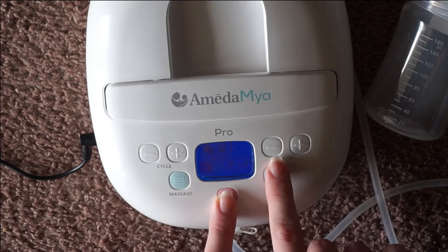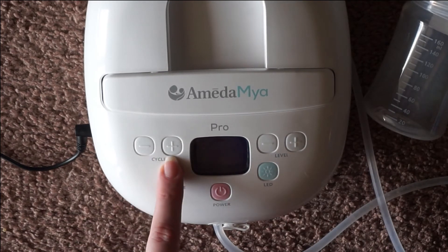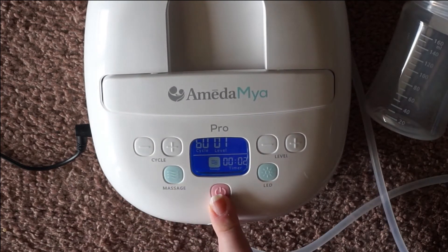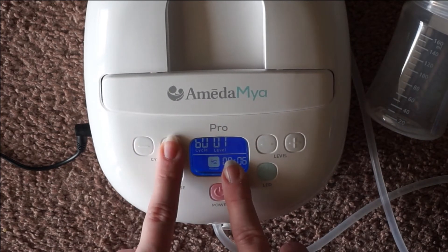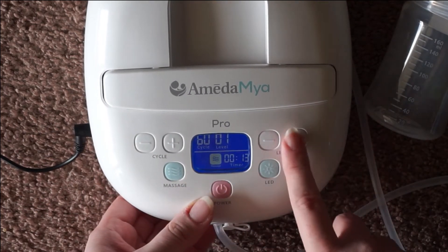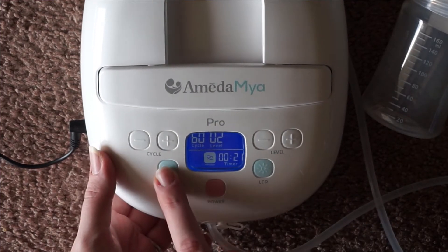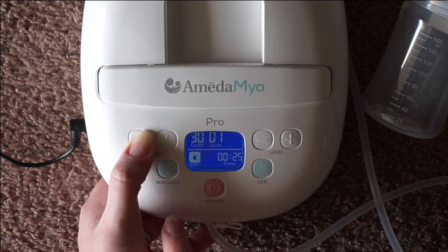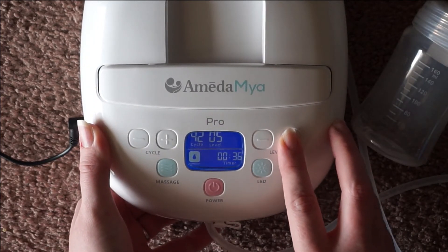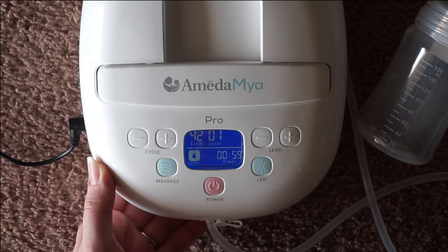Right here are your suction levels — this is to decrease suction, this is to increase suction, this is to decrease frequency, and this is to increase frequency. This button interchanges between massage and expression mode. My recommendation is to start off in massage mode. There's only one cycle rate in massage mode — you cannot alter it no matter what you do, but you can increase the suction. If you go over to expression mode, you can adjust the cycle rate, increase or decrease it, and the same goes with suction. It's got a lot of different suction levels, and it's just as simple as hitting that button to alternate between modes.